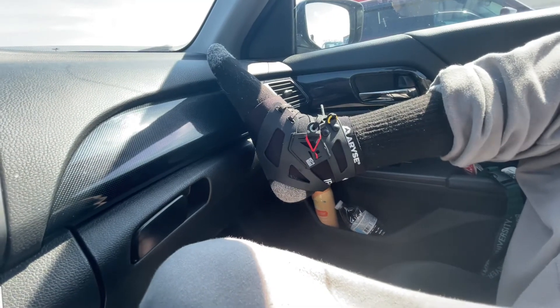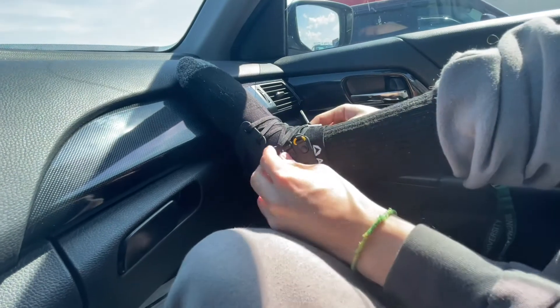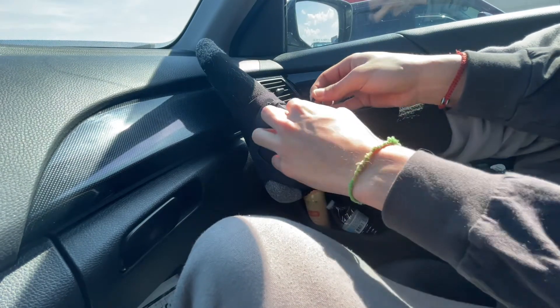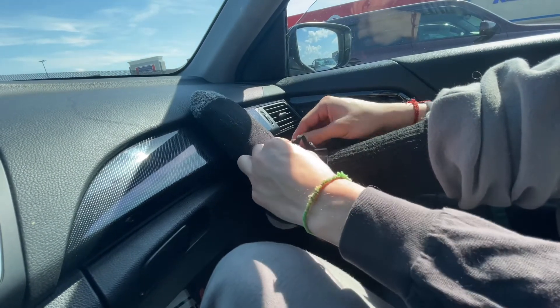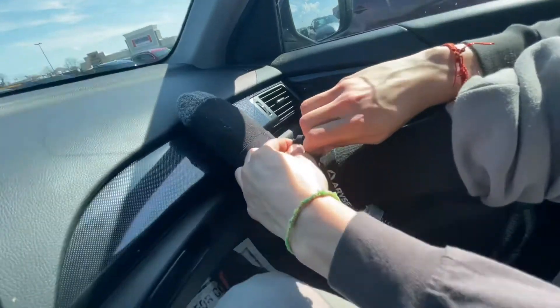They gave me an extra shoelace — that's cool. So how do you use it? That feels nice. I apply pressure here and then I tighten it at the D-ring up here so it stays in place.